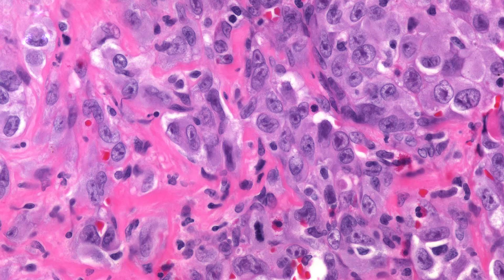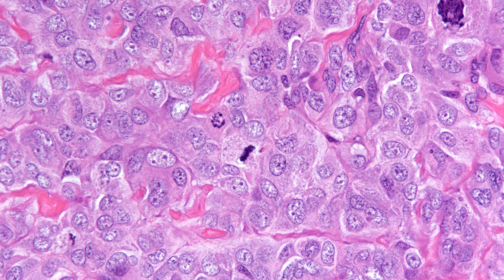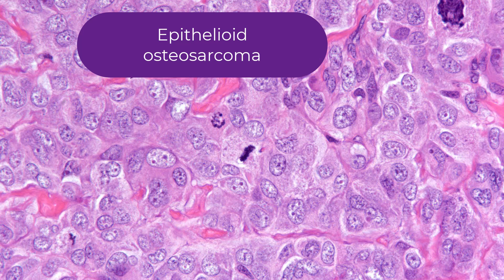Here's another epithelioid tumor, but this one looks far more malignant — this is an epithelioid angiosarcoma. You're not going to mistake this for a chondroblastoma given the obvious malignant features and mitotic activity. However, I bring this up because the great mimic in bone pathology is the epithelioid osteosarcoma.